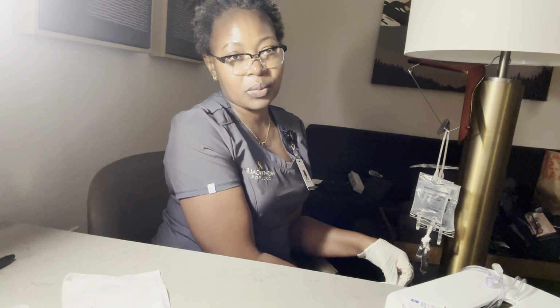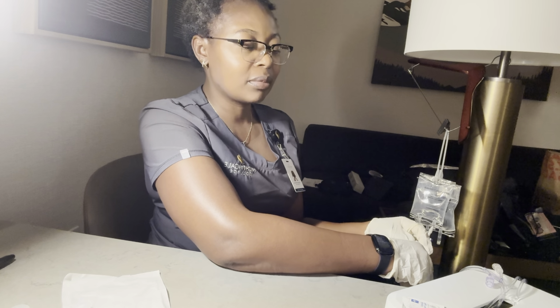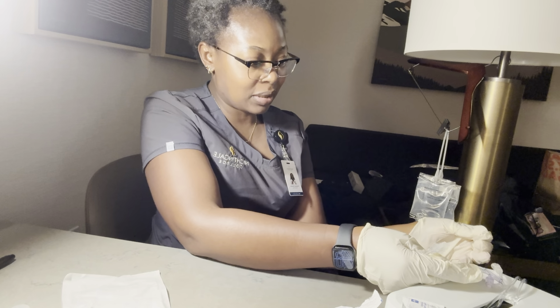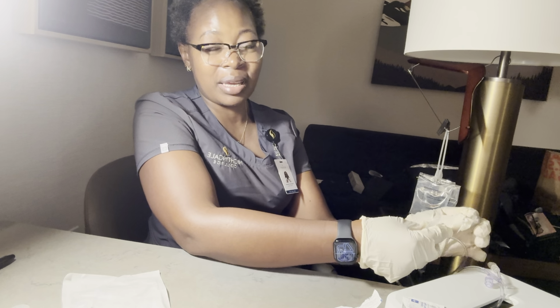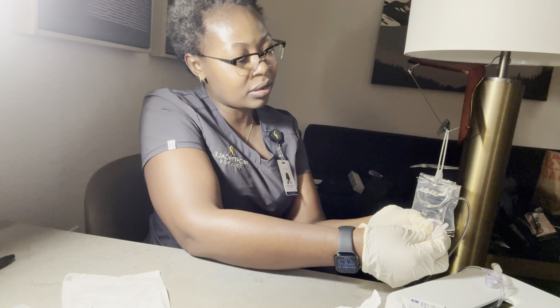I need to connect the secondary, but before then I need to see whether I have 100 ml. I need to connect with my secondary, so I'll go ahead and clean my secondary connection, my Y site. So I'm going to clean it with an alcohol wipe to make sure that it's clean and sterile.